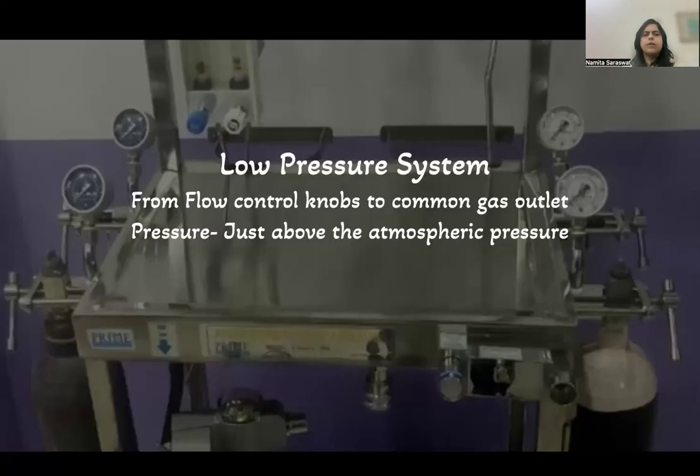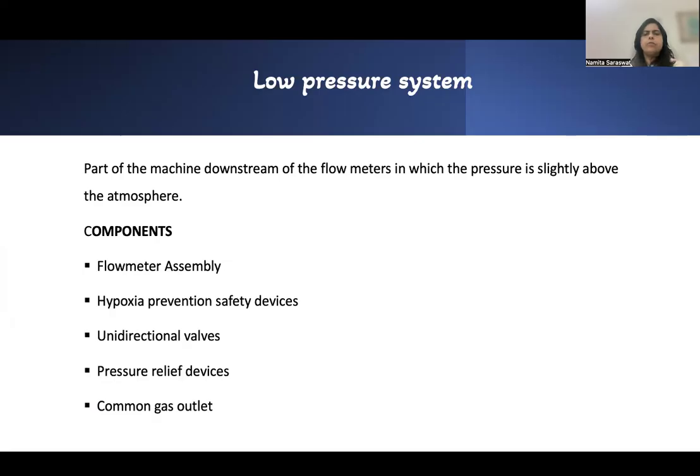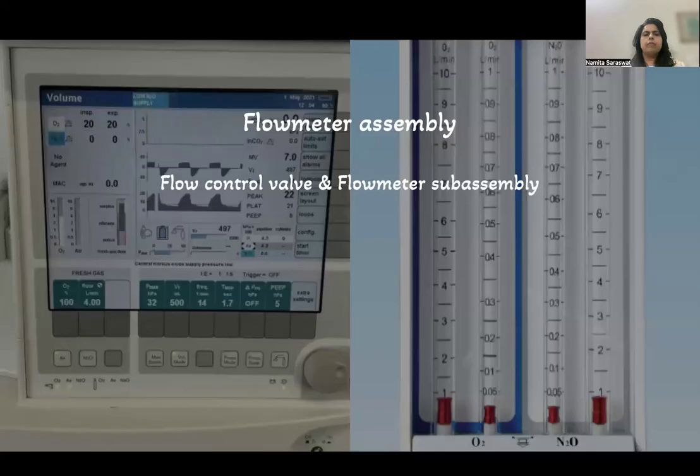Now moving on to the low pressure system. The low pressure system is from the flow control knobs to the common gas outlet. The pressure here is just above atmospheric pressure. So the low pressure system is the part of the machine which is downstream of the flow meters, in which the pressure is slightly above the atmosphere. The components of this low pressure system are the flow meter assembly, hypoxia prevention safety devices, unidirectional valves, pressure relief devices, and the common gas outlet. We'll discuss each and every component one by one.